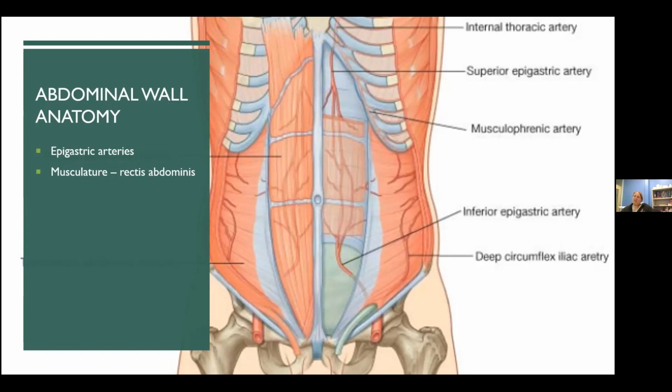You also, again, have the musculature. So your rectus muscles are nice, solid muscles. They run strongly through the middle of your abdomen. And then there's areas where they're a little bit thinner. So you can use ultrasound to help identify that.